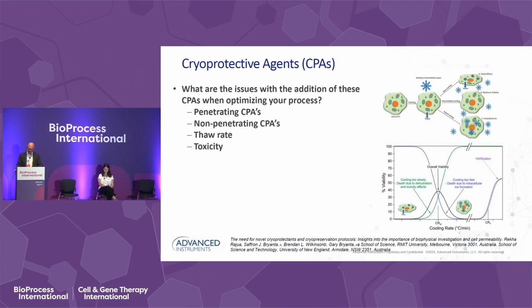Penetrating CPAs are often small, non-ionic molecules that are highly water-soluble at room temperature. These low molecular weight compounds effectively penetrate the cells and prevent intracellular ice formation. Because of their penetrating nature and their ability to interact with cellular components, including enzymes, penetrating CPAs tend to be more toxic than non-penetrating. During warming, a rapid warming rate is preferred to prevent recrystallization, and the removal of the CPA is required to prevent cytotoxicity.